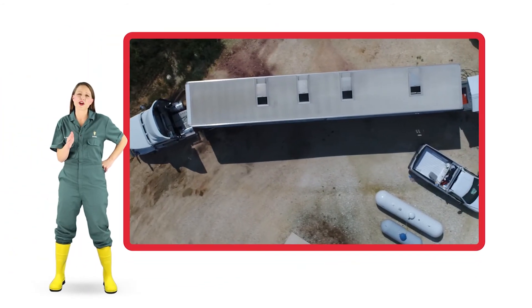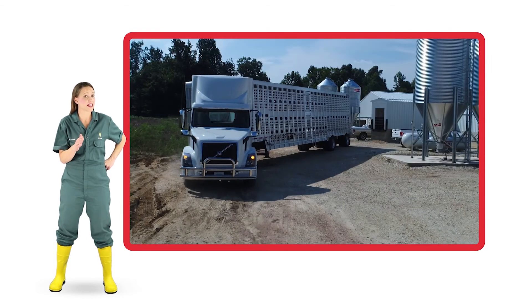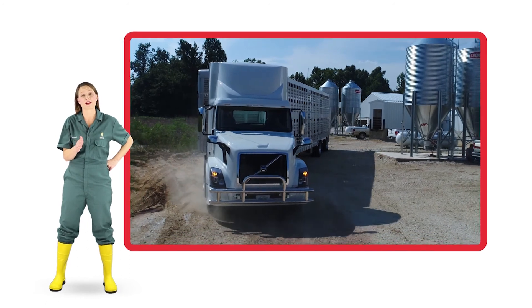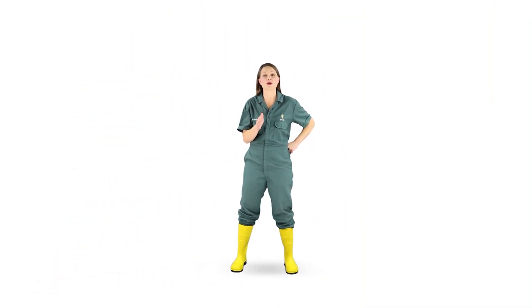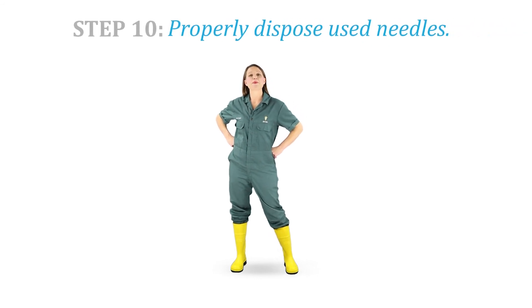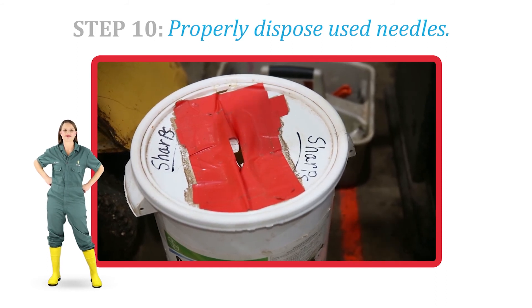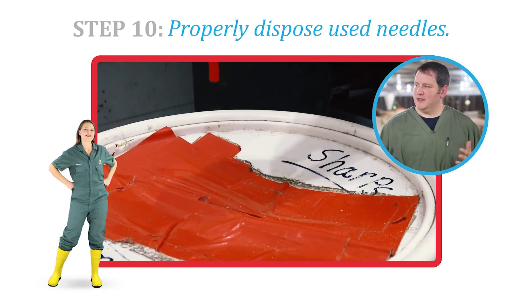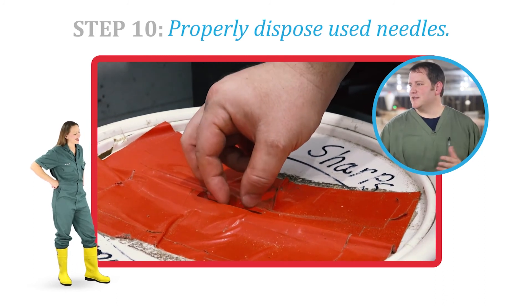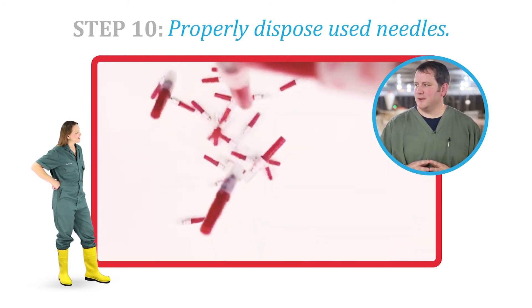On your farm, it may be possible to send the sow to market. In this case, good communication with your packer is critical. Follow your farm's protocol. Step 10. Properly dispose of used needles in a sharps container or a hard plastic container. We don't want to leave used needles laying around on shelves or in the barn. All needles need to exit the barn and be disposed of properly.